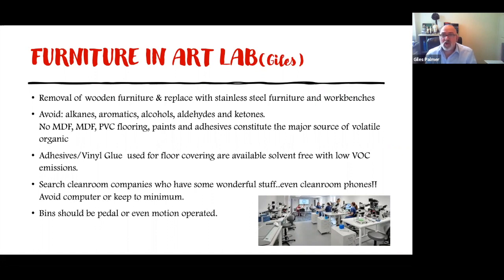Chairs, for example, should not be fabric. So again, you should look at ones which can be easily cleaned. Take your examples from the clean room industry, but you can readily find it elsewhere. You just have to think, is it cleanable, and how are you going to do the infection control afterwards? Thank you, guys.